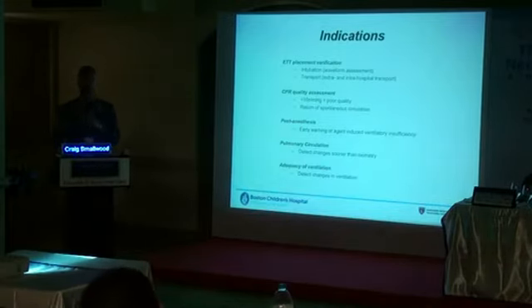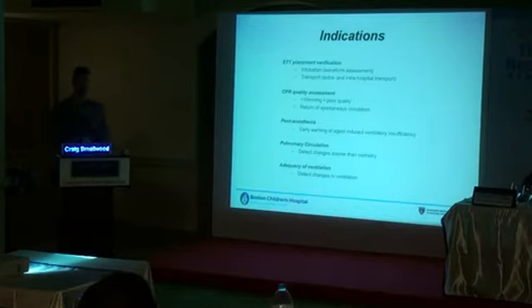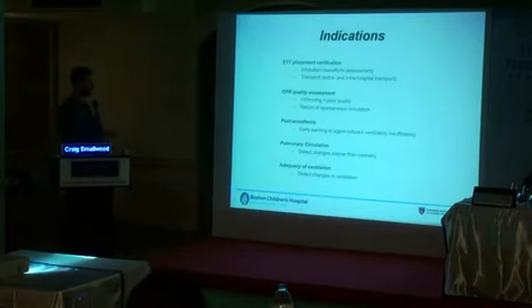But otherwise, if they can tolerate the dead space, if they can also tolerate the weight of it, it's not going to rip off their endotracheal tube, then we'll monitor it continuously. And that allows us to ensure that endotracheal tube is in the correct place. So CPR quality, anything less than 10, almost across the board is poor quality. Return of spontaneous circulation, you'll have a marked increase in CO2.